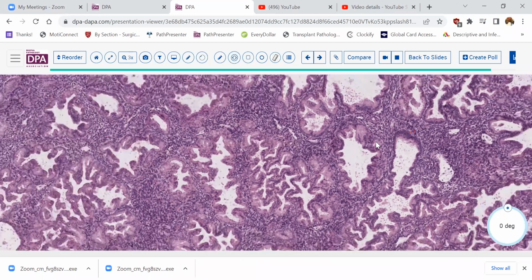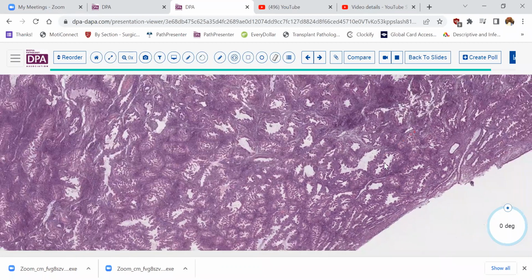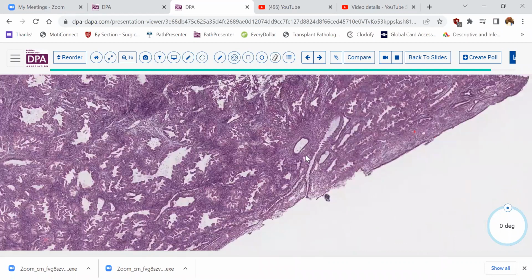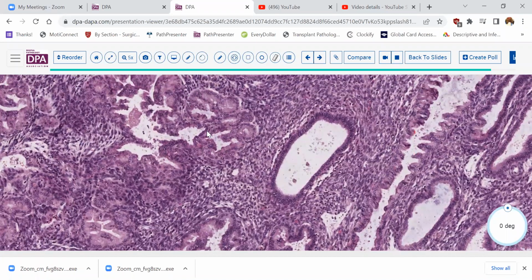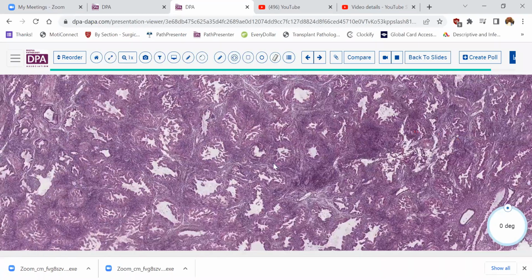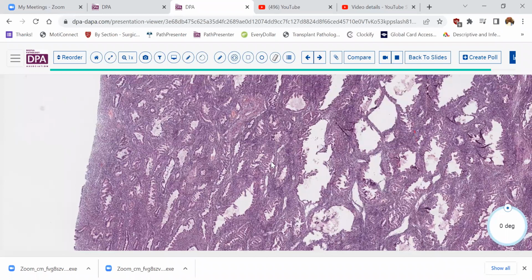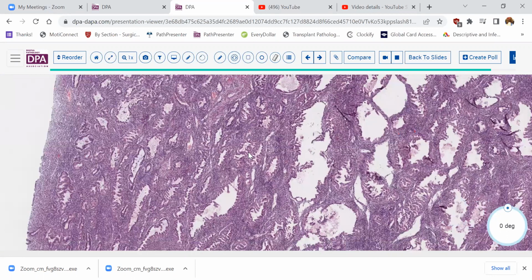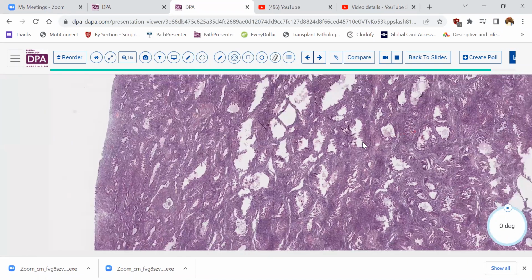So is this atypical hyperplasia or is this a more typical, or not atypical, hyperplasia? Well, one clue would be, can we find really any significant cells that look different from these? There may be one or two glands, but I wasn't completely satisfied that we really had a separate population of glands in this lesion that would show evidence of a clonal proliferation, if you will, of this type of epithelium. The other feature here, of course, is we have some thick-walled vessels that suggest that this is an endometrial polyp.